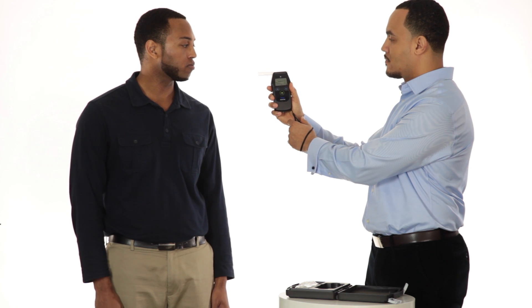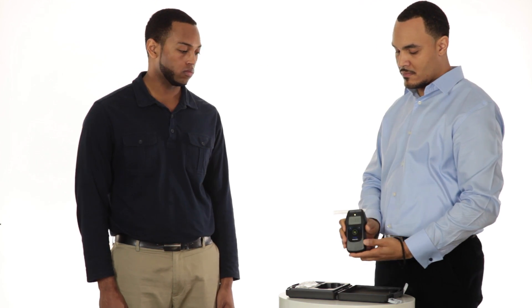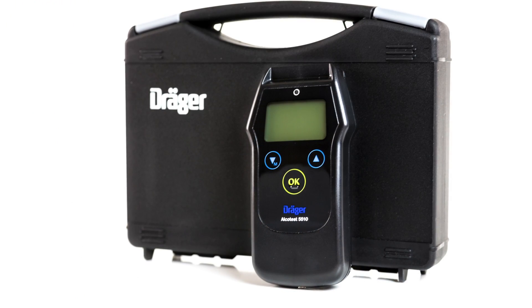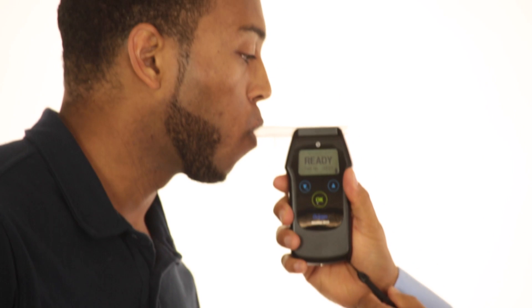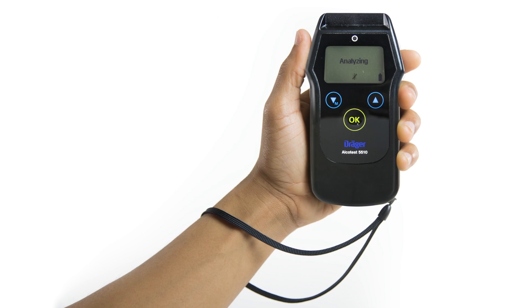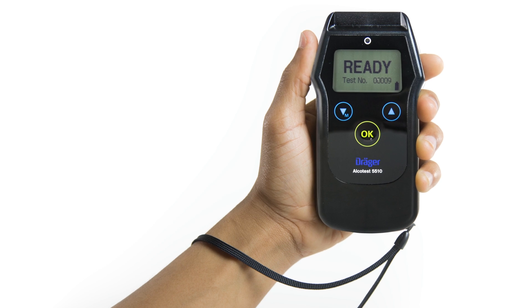You can trust the Alkotest 5510 because it is based on more than 60 years of innovation from Draeger, a world leader in medical and safety technology whose products monitor, support and protect human life. We are committed to saving lives one breath at a time. With the Alkotest 5510, you just sample, read and proceed.